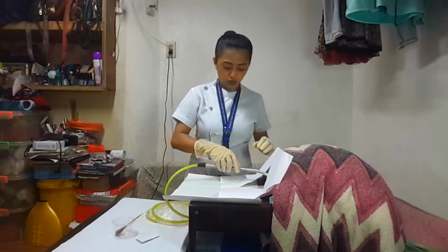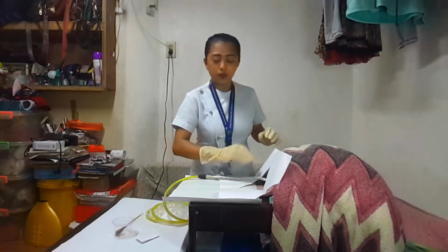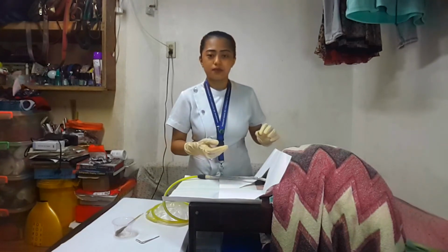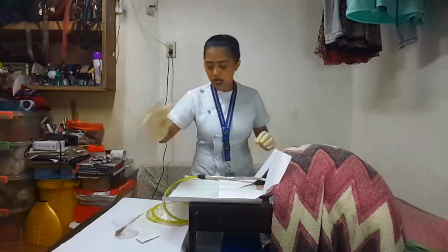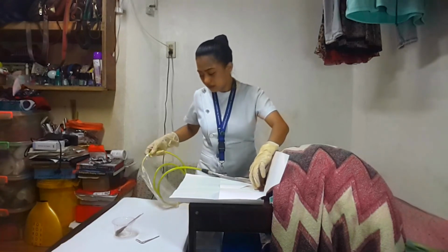thigh of the patient. So, here, let's assume that this is the thigh and we've already placed a tape here, using a non-allergenic tape, so that the rationale is to prevent any allergies caused by the tape, and also for the catheter to stay in place, because it has a tendency to be moved because of the patient, so we need to secure it. And also the drainage bag, we need to hang it on the side.